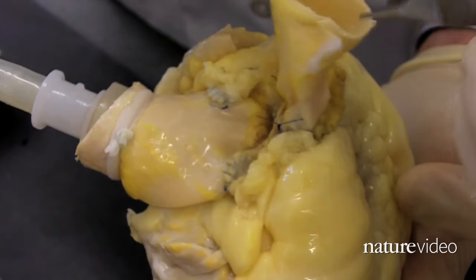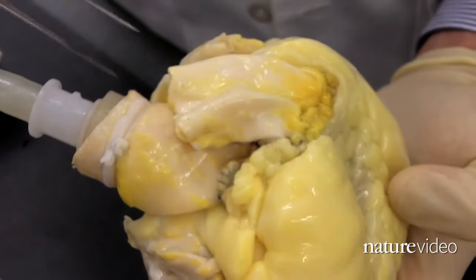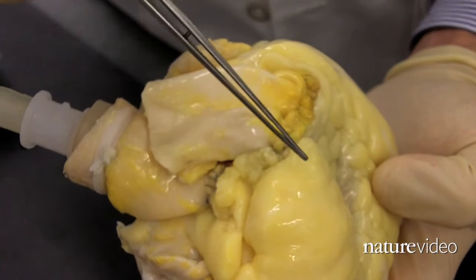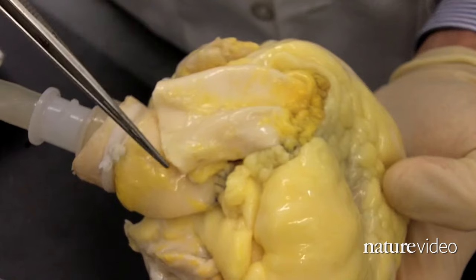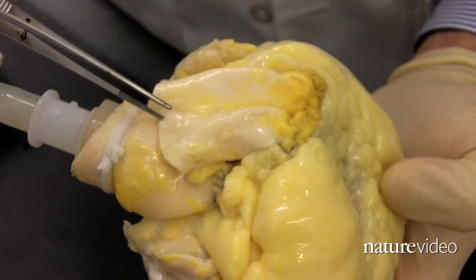And the same thing here — this is the pulmonary artery and the right ventricular outflow tract of the cadaveric heart. And this is the graft, the decellularized graft that has been sewn onto the heart.